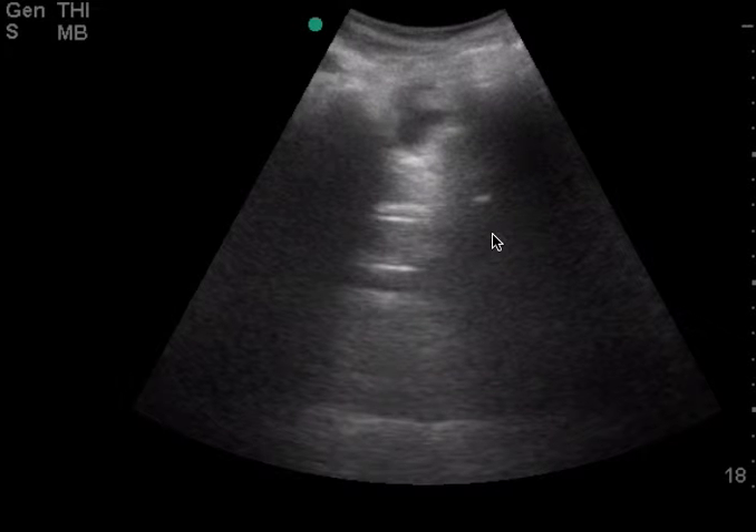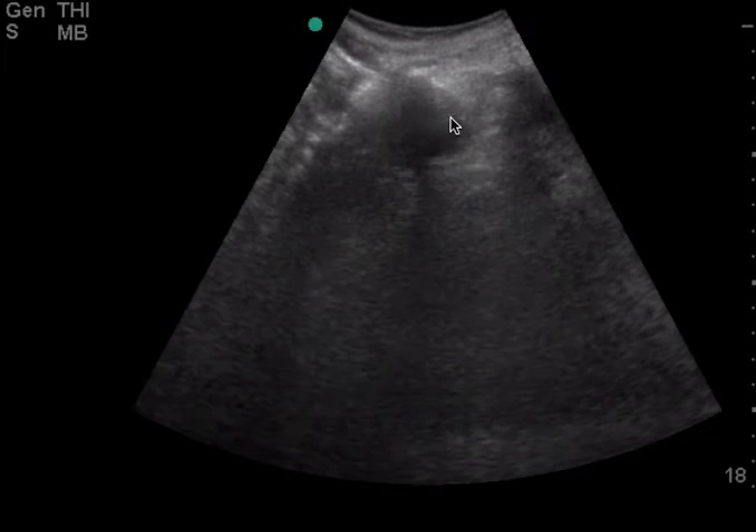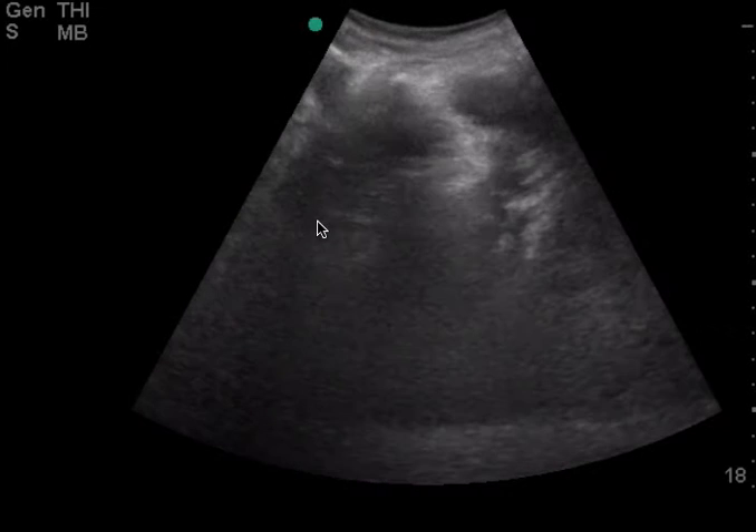Also, maybe it would help to try to put some more firm pressure just to get some of this bowel gas out of the way, which is why I think we're having trouble seeing the pelvis. But based on this view, I can't really make a clinical decision based on the pelvis.